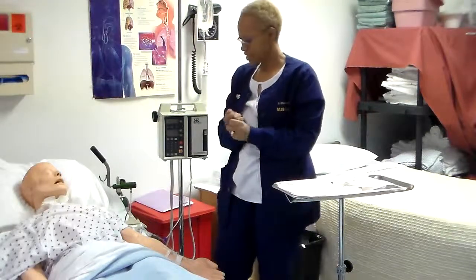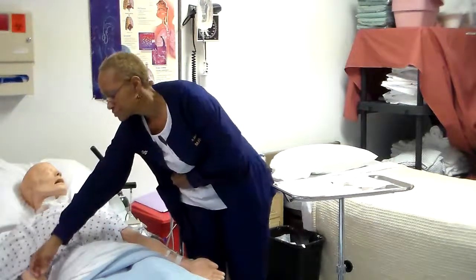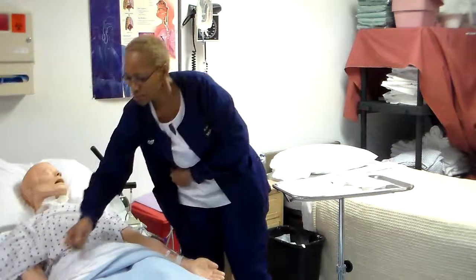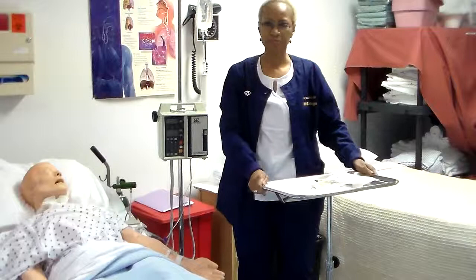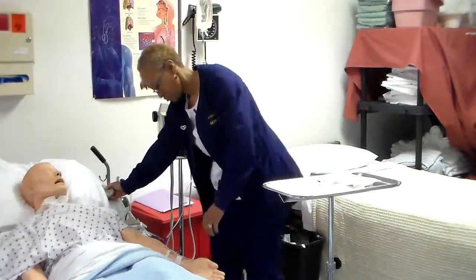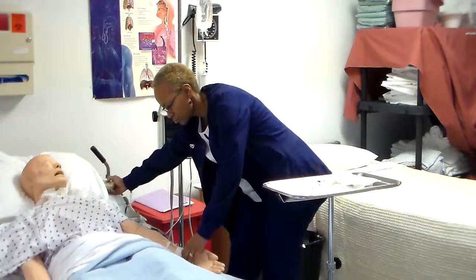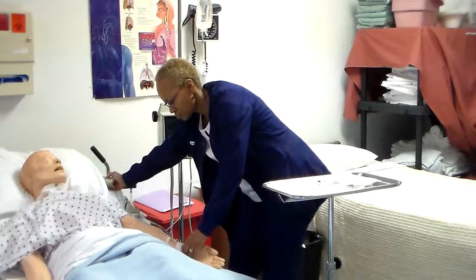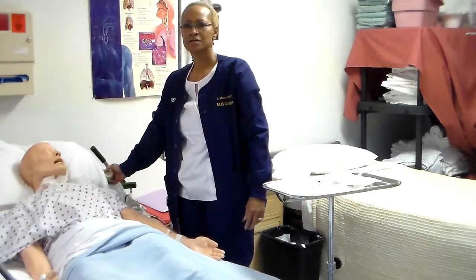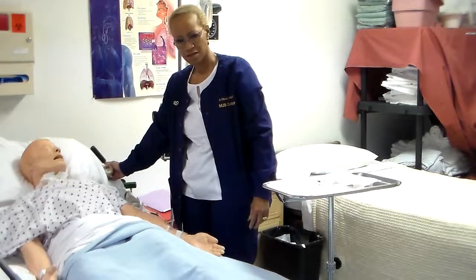Perform standard steps. Assess IV insertion site for signs. Your name, full name, and date of birth? James Johnson, 1932. All right, great. Assess IV insertion site for signs of infiltration or phlebitis: redness, pallor, swelling, tenderness, palpation.